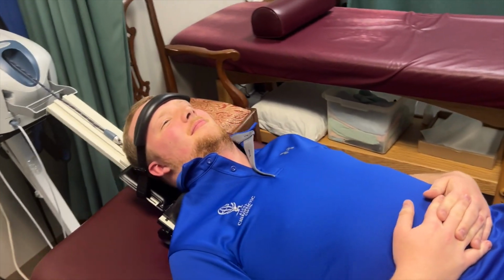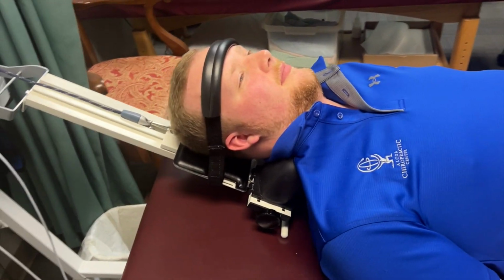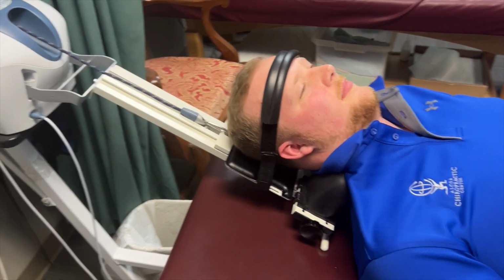How long does the treatment last, and how many sessions do you typically see? For most patients, the protocol that we use has the patients starting at a minimum of 20 minutes and can go up to 30 minutes. It depends on what the approach is and how strong we want to go, the weight versus time. We've settled into closer to a 20-minute type of therapy and see that we get the best results with that.